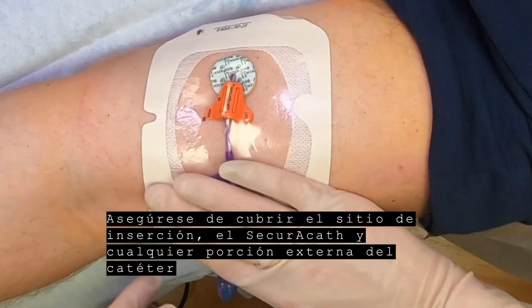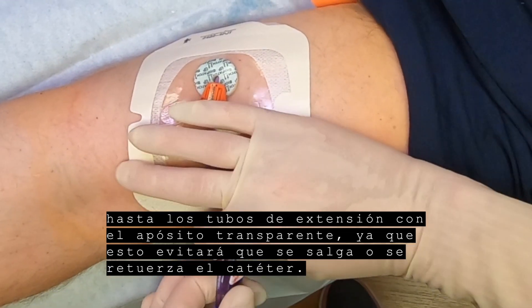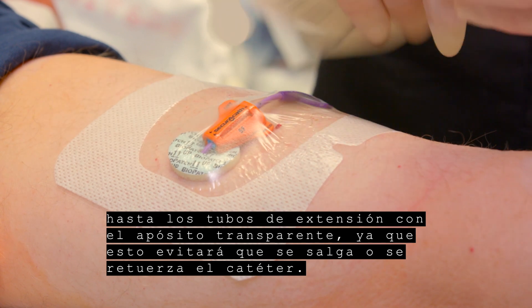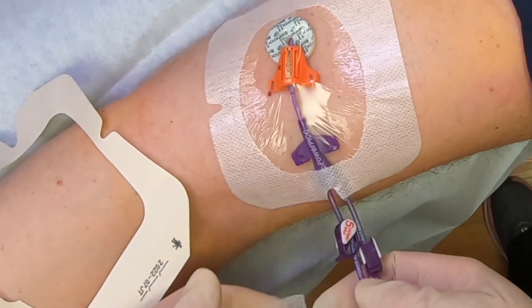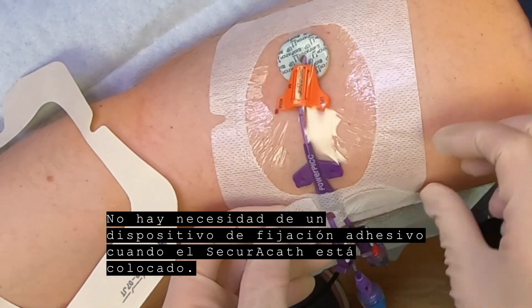Be sure to cover the insertion site, the SecuraCath, and any external portion of the catheter up to the extension tubes with the transparent dressing, as this will prevent pulling or kinking of the catheter. There is no need for an adhesive securement device when the SecuraCath is in place.